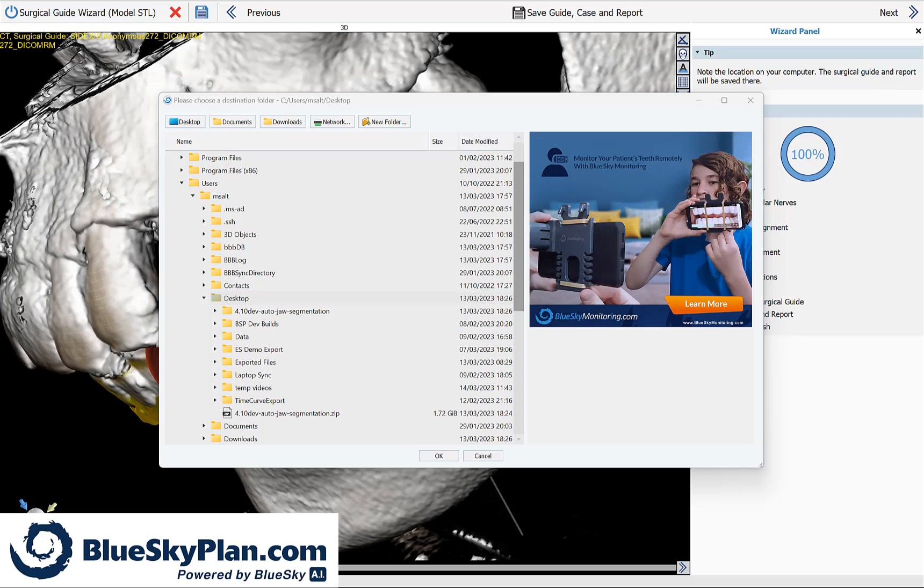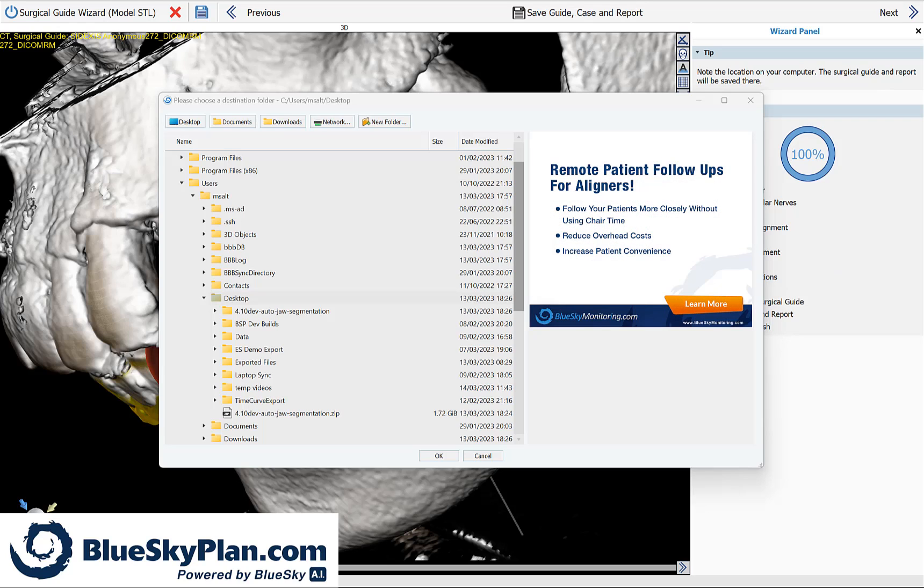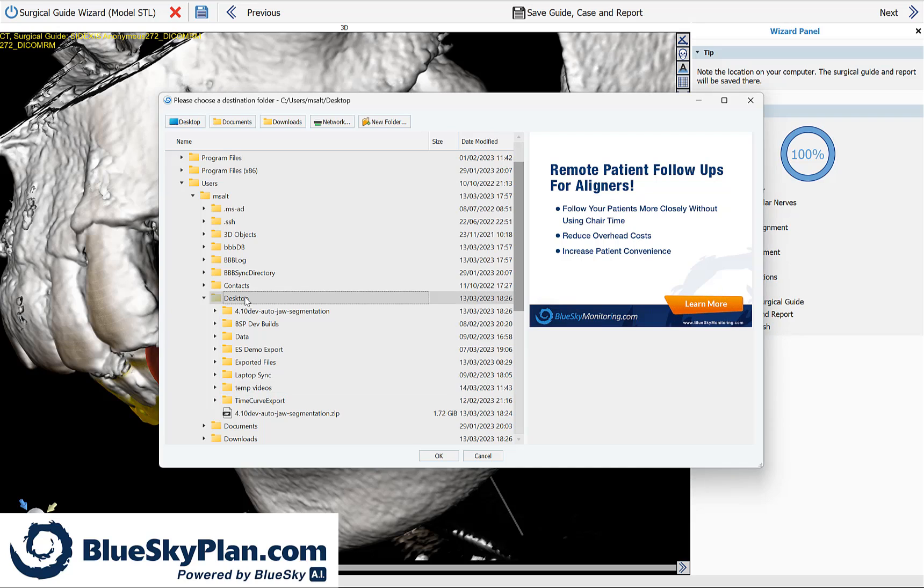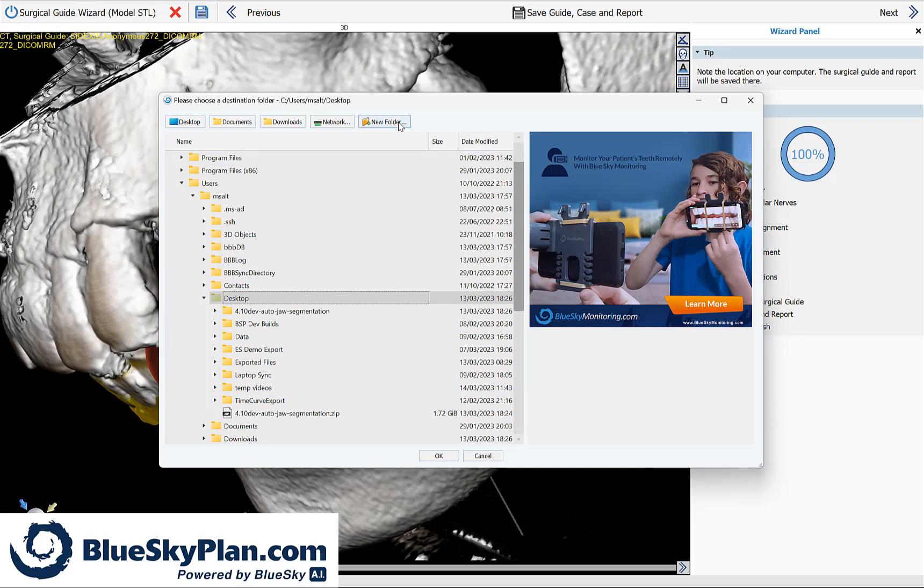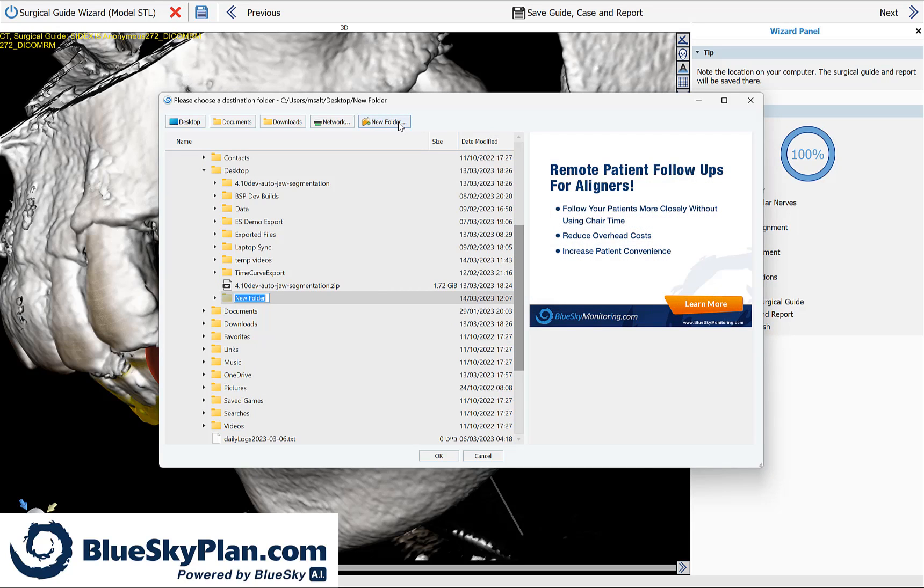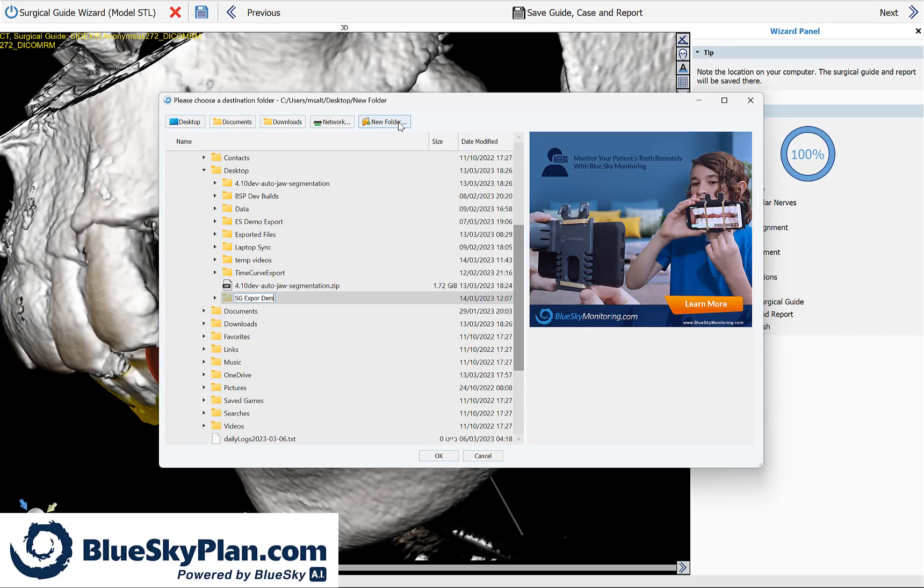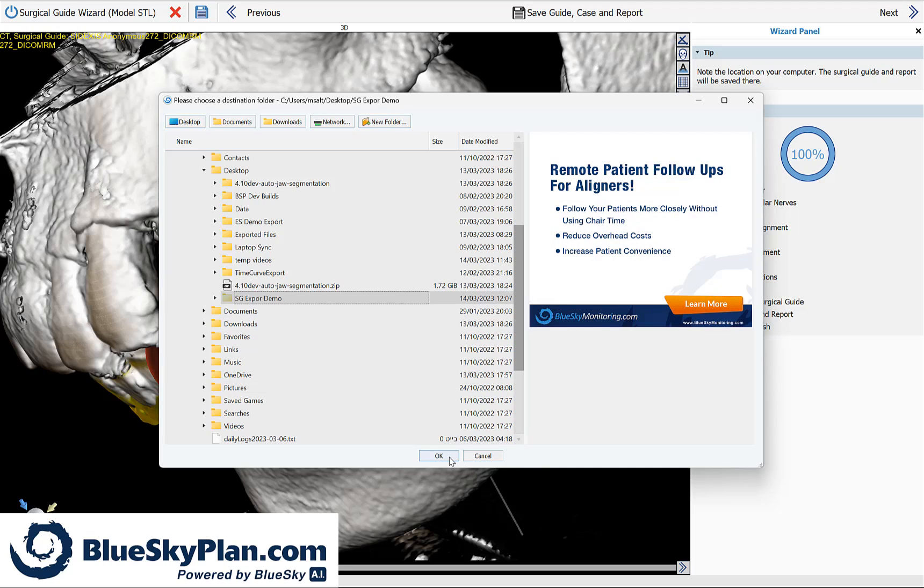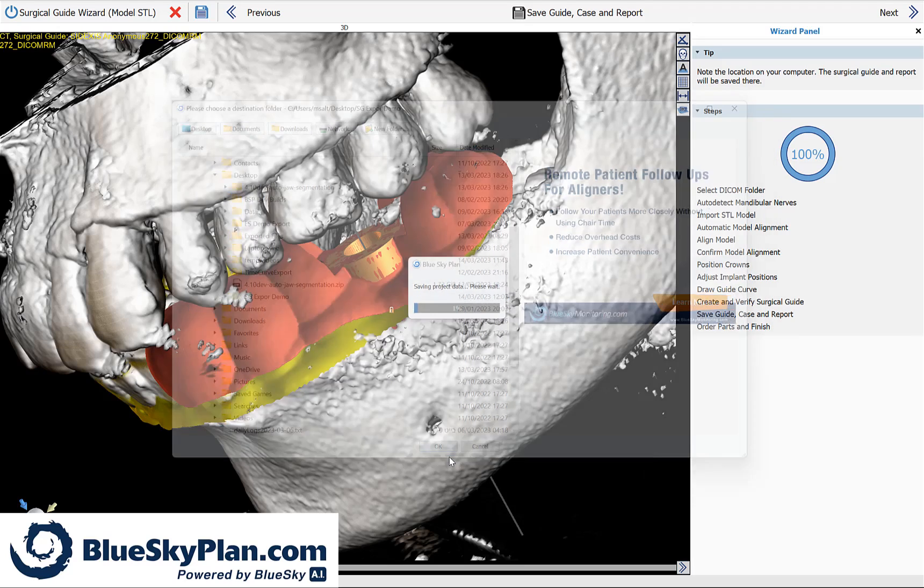The software now prompts you to choose a location where the surgical guide should be saved. I'm going to save it to my desktop. I'll click on new folder to create a new folder and I'll call the folder SG for surgical guide export demo and click on OK.